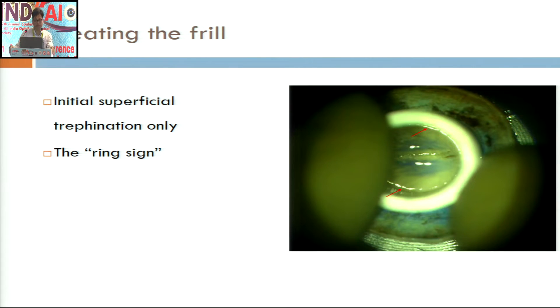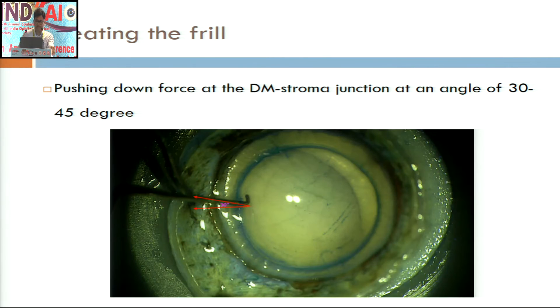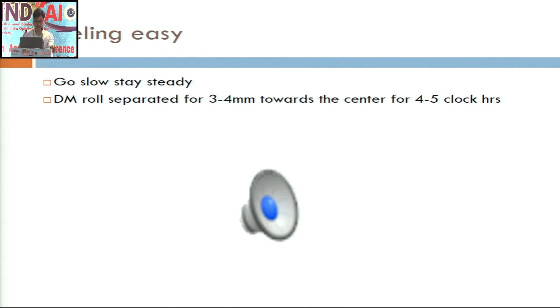One important step for creating the frill is partial trephination. If you do a full-thickness trephination, then peeling becomes almost impossible. An important sign, as pointed out by one of my SRs, is the ring sign: if you can appreciate a ring of reflex within the inner margin of the manual trephine and it is broad, you are too deep; if it is relatively sharp, you are quite superficial. When creating the frill, always apply the pressure of the Sinski at the DM-stroma junction at around 30 to 45 degrees. Never apply pressure directly over the Descemet membrane.